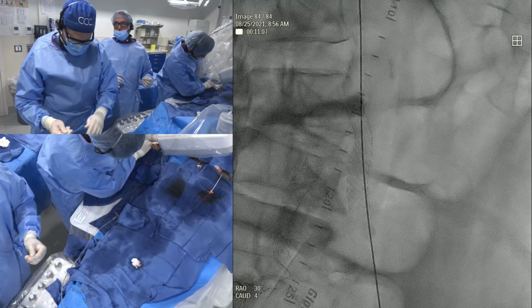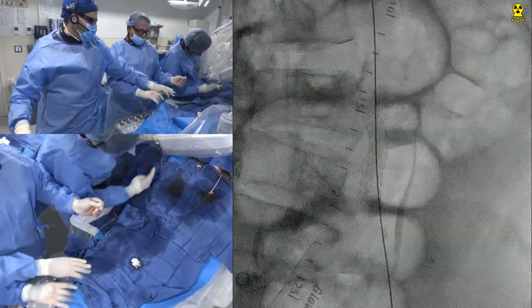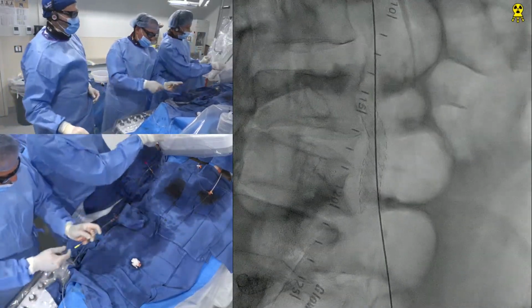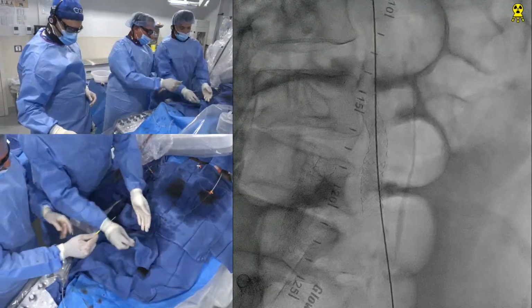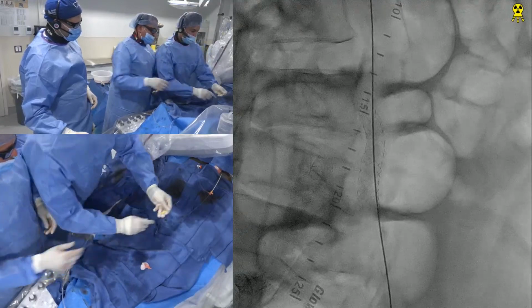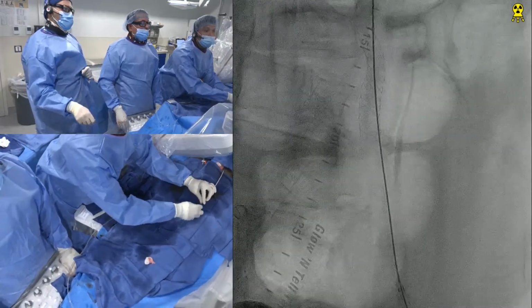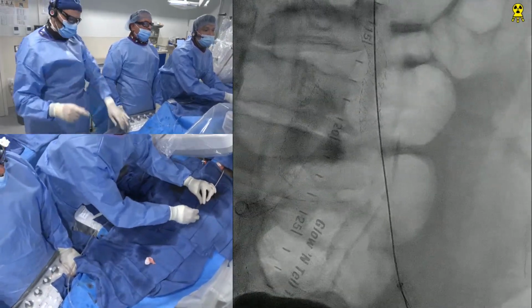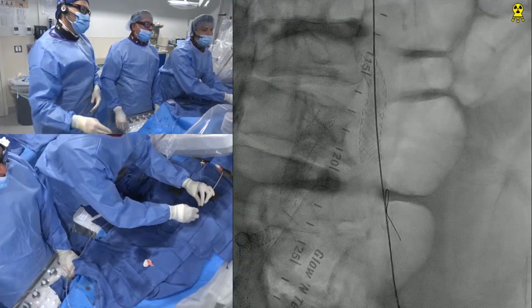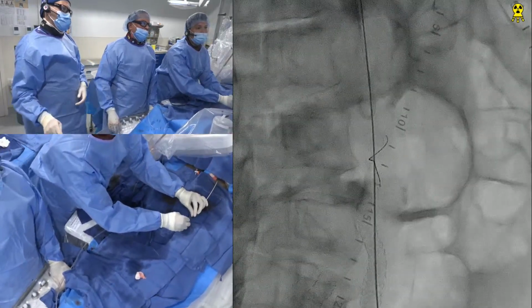So, I don't want to promote stents, but in certain special areas, Peter Ferries, our esteemed chief of vascular surgery here, and I did some work on carotid stenting with closed cell versus open cell, and we actually found that we had less debris in the filter with the closed cell, which is nice. The open cell will also allow for capture of the stent struts. That's the problem. When you go through with other devices, the stents may cause issues. Just push it up, you'll be fine.